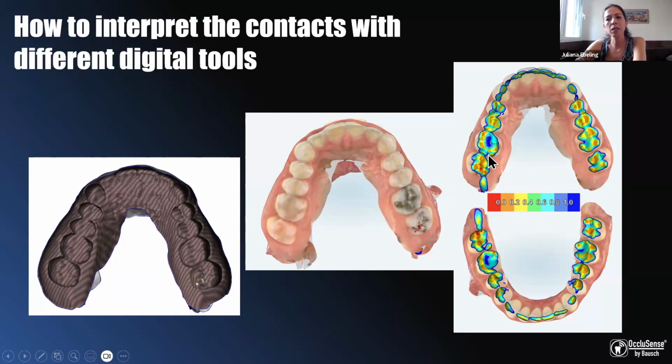And when I consider the orange color, I have 200 micrometers. Here, it's 400. This doesn't happen from yellow forward. We don't have this happening. So we have to pay attention to this scale. With some scanners, we can adjust this scale. This is very nice. I will show you how to do that. But with some, we cannot adjust it, and we are very limited with this data.